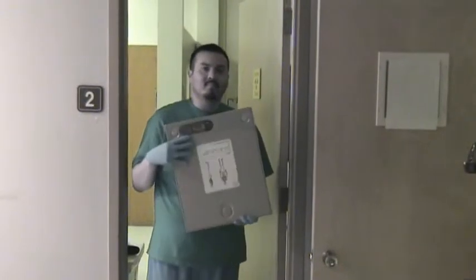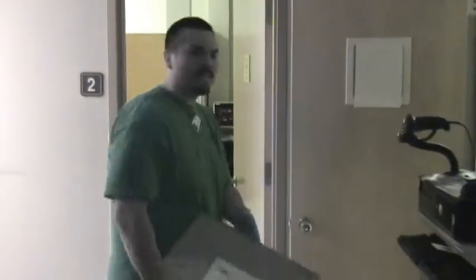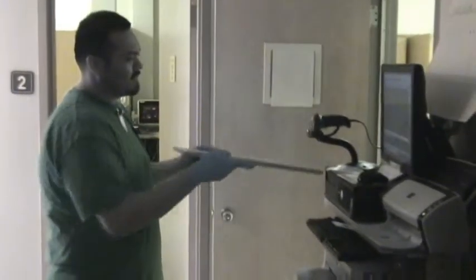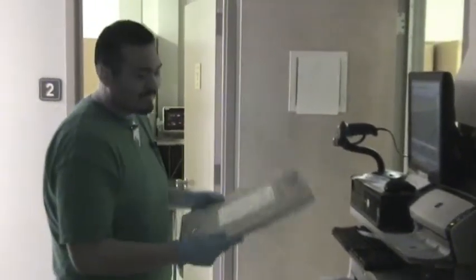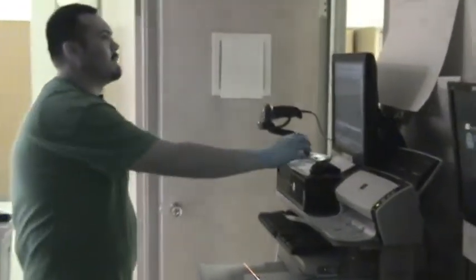You want to take your cassette over to the reader. Nice moves. There it is. Scan your cassette. Feed it into the reader. Give a little smile, and you're ready to critique.